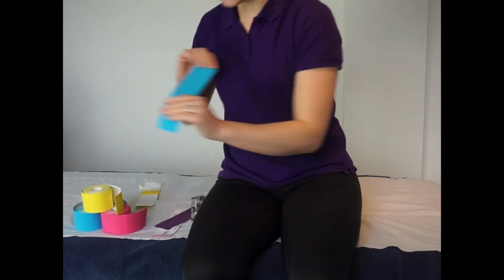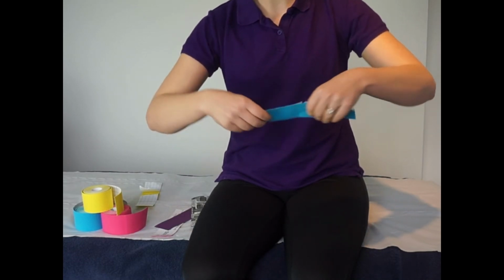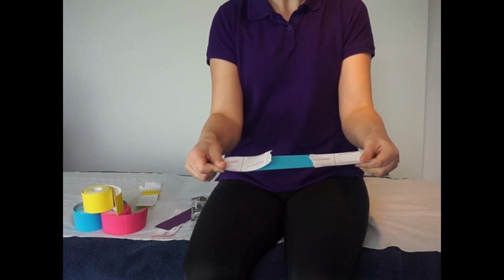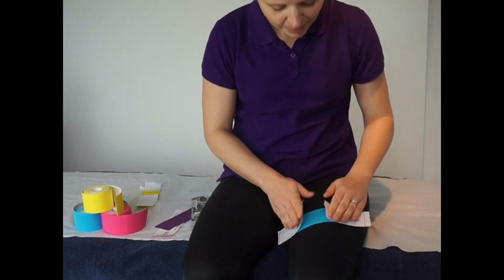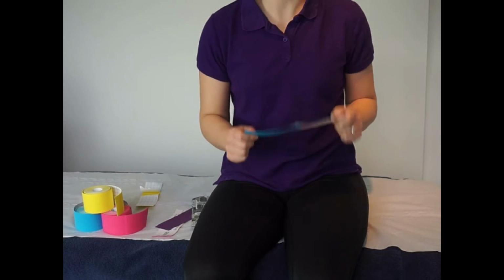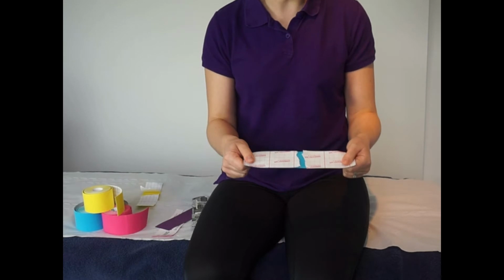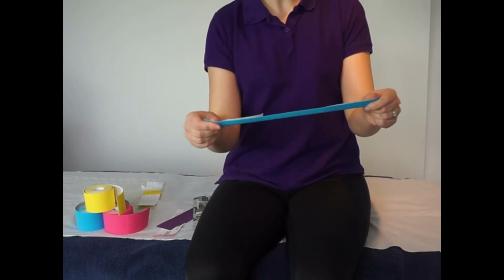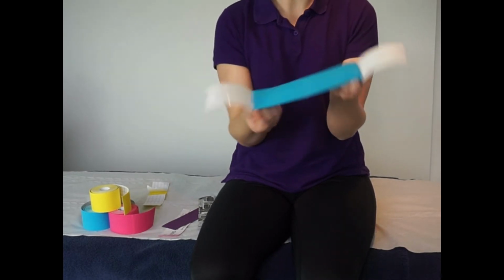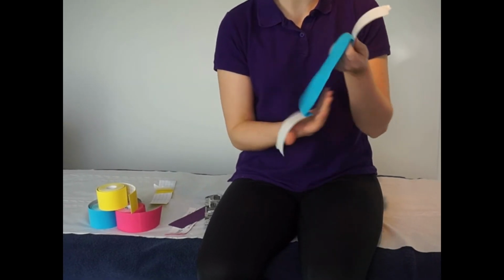Next one we're going to go for the blue one. So again, same thing, we're going to rip the tissue away from the tape, and then I'm going to pull away gently. So this one doesn't come off as easily as the yellow one, but you can still see there's some sort of give. But if I push that back down, there's a bigger gap there, so actually the recoil on this tape is a lot less, so it doesn't have that spring back capability as some of the other tapes do out there. And again, if I'm pulling this one apart completely, the tissue, the paper has just come away from the tape, it's just not very sticky, and that's not going to last 4 or 5 days that we want our clients to experience.